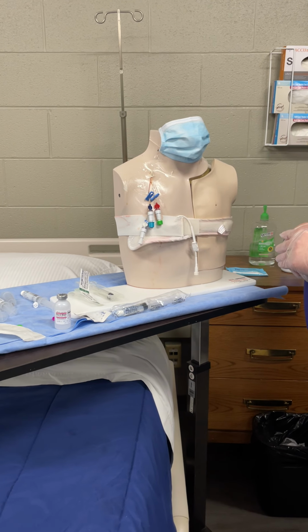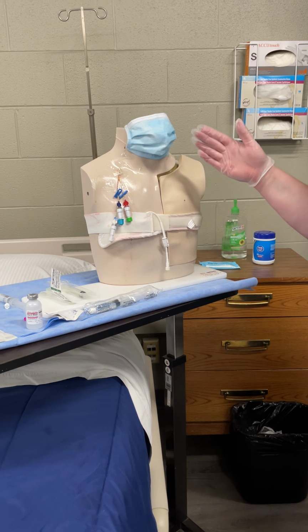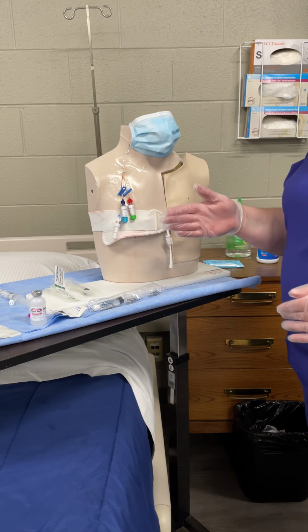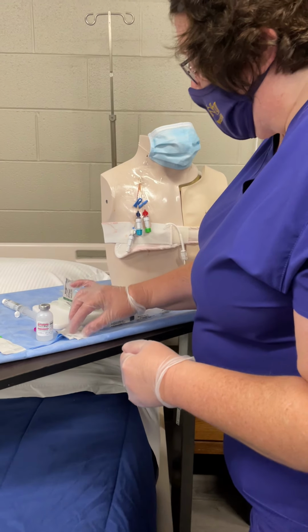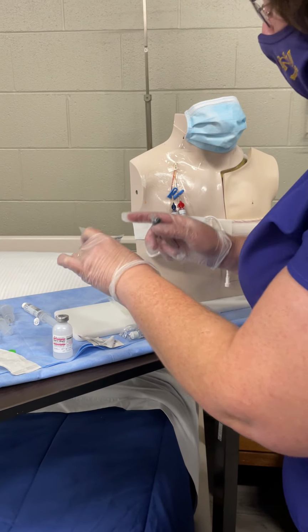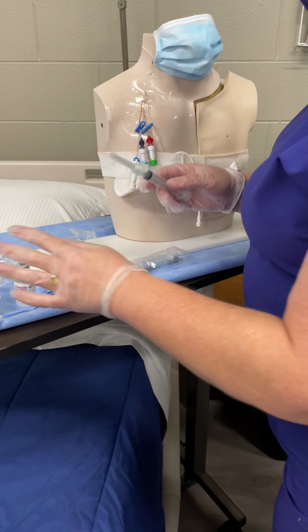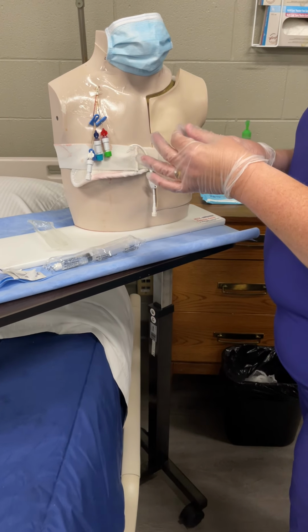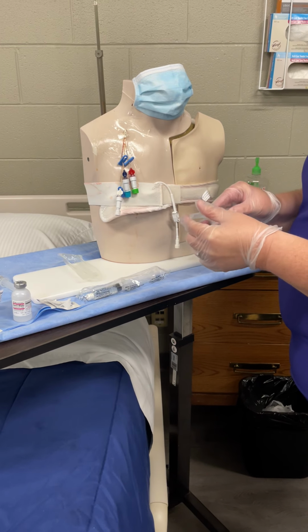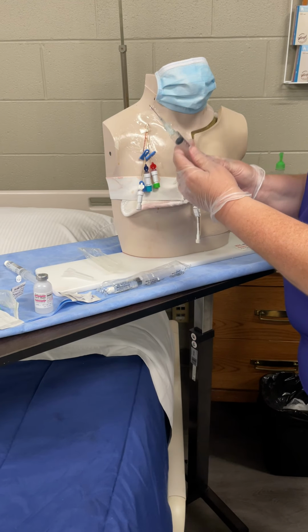We also want to make sure that our CVP line is patent, so having checked to make sure the dressing's intact and that we have a good blood return, we're going to draw this medicine up in our med room. So we're going to clean off our vial. We're going to get our syringe, always a 10 mL syringe when you're giving meds through a CVP line or a port or any inserted line like this, because of the pressure. If you give it in a smaller syringe, it's going to blow your line. Okay, so we're going to draw this back to that 2 mLs.